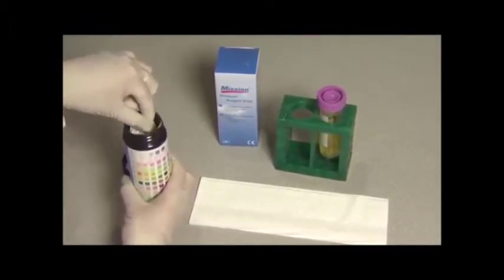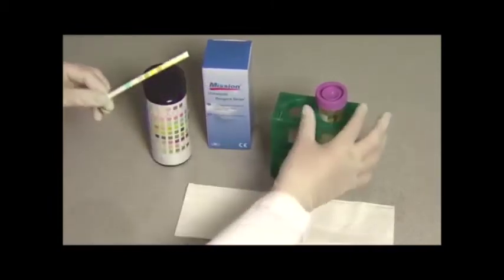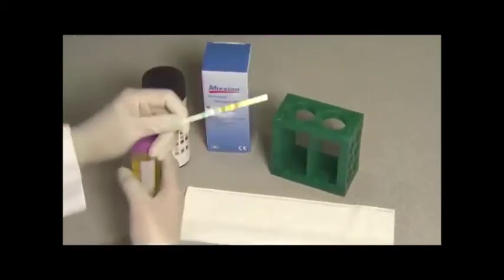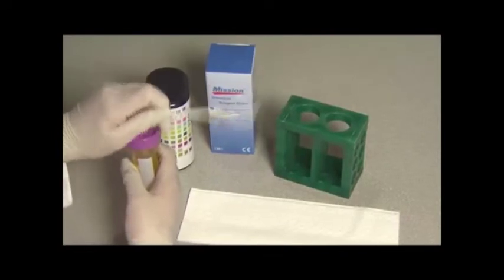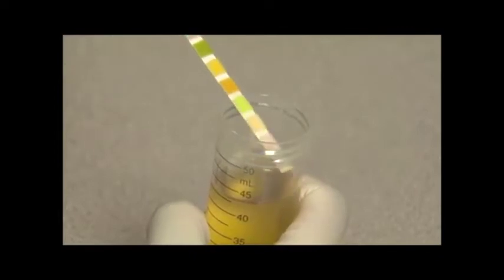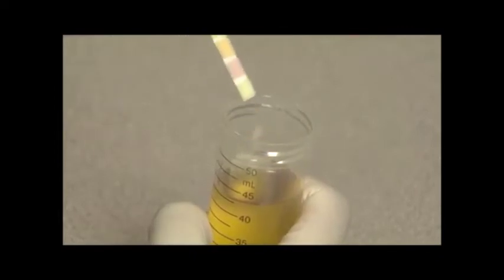The operator has three seconds before the triple beep sounds to immerse the strip into the urine. Immerse the reagent areas of the strip into the specimen for one to two seconds after hearing the beep, then run the edge of the strip against the edge of the urine container to remove excess urine.